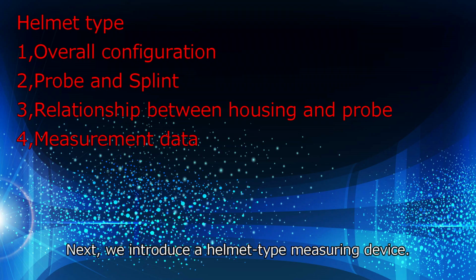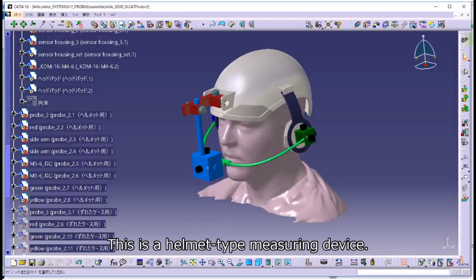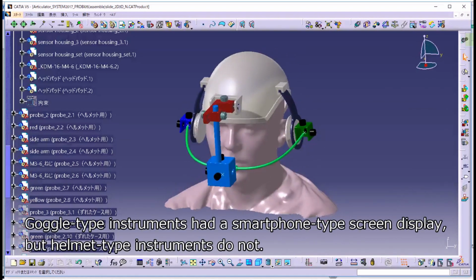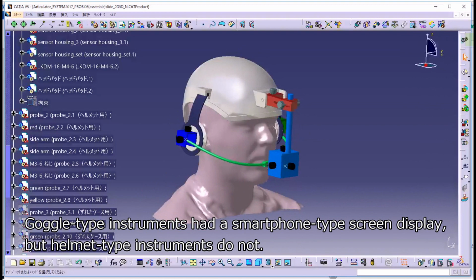Next, we introduce a helmet-type measuring device. 1. The overall configuration. This is a helmet-type measuring device. Goggle-type instruments had a smartphone-type screen display, but helmet-type instruments do not.